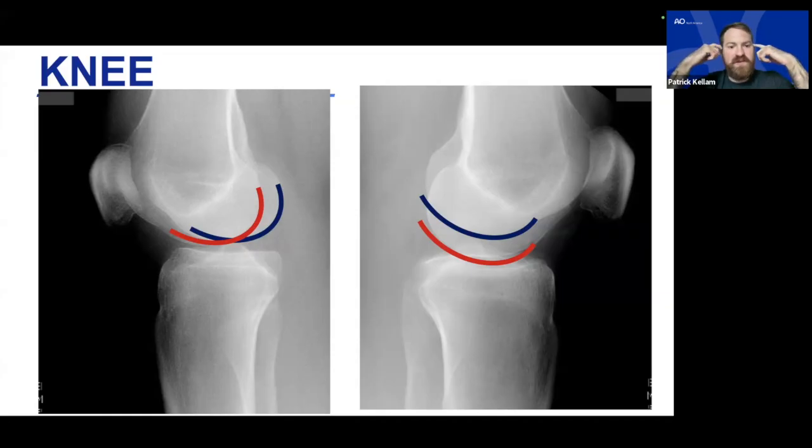The image on the left here, that's a rotational. The condyles distally are at the right level. They're just internally or externally rotated. And then deciding which way to go can be a little more difficult to know, but that's a rotation thing. Whereas the image on the right, the posterior aspect of the condyles are totally lined up. So that's an adduction, abduction, or a wigwag, or moving the leg in and out kind of thing that would allow you to get a better image there.